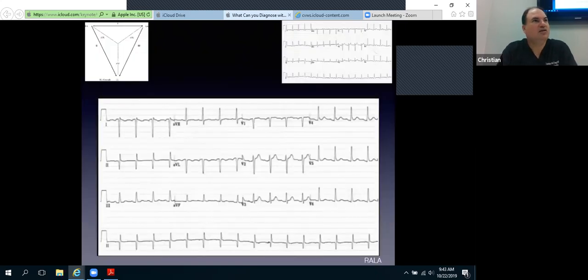Because it goes like this, and then it goes like this. Right. Does all these different things, right? So these are different examples of flipping leads. This is where I told you, if you really want to know how to use an instrument, play it badly, and then learn how to play it right. So here, purposely, you switch the right arm electrode and left arm electrode, right? Now, the computer doesn't know any different.